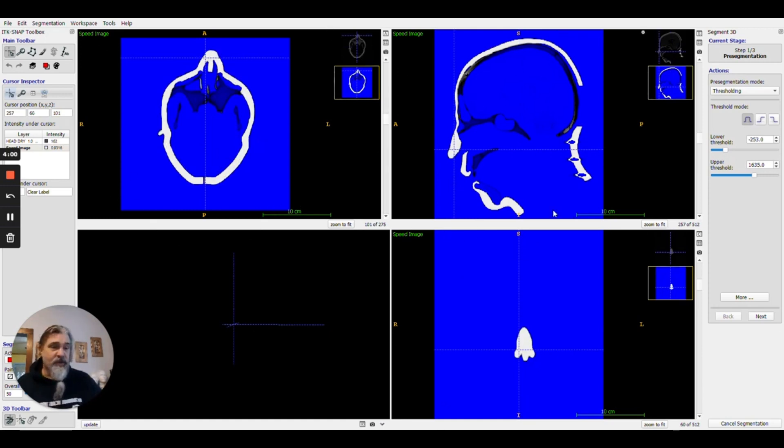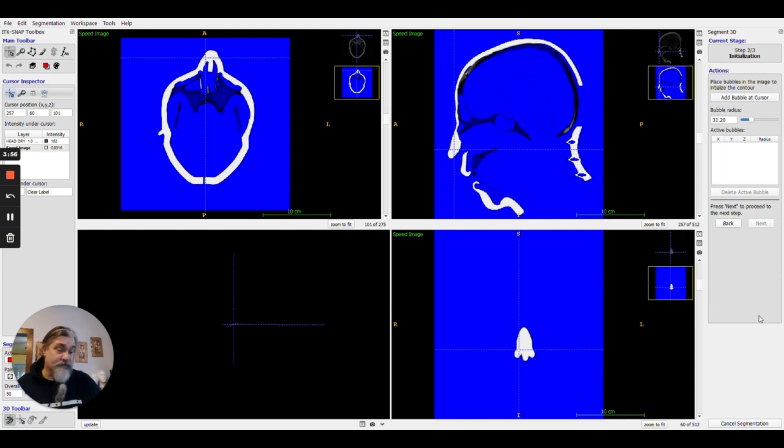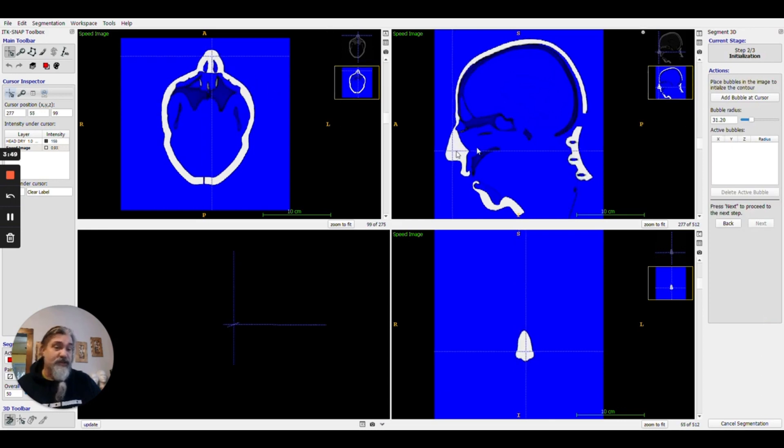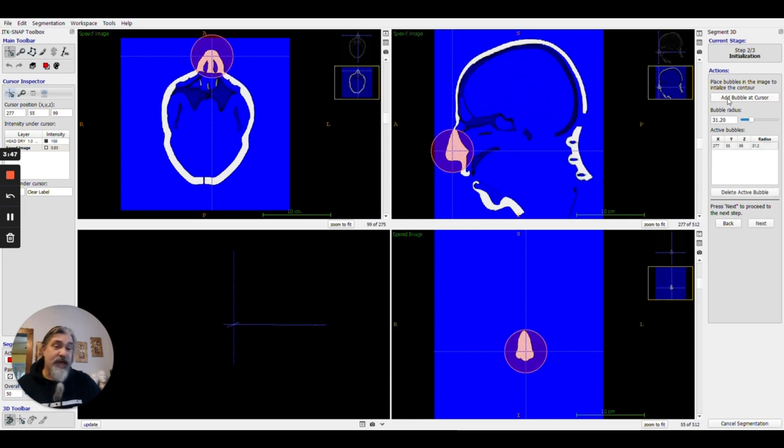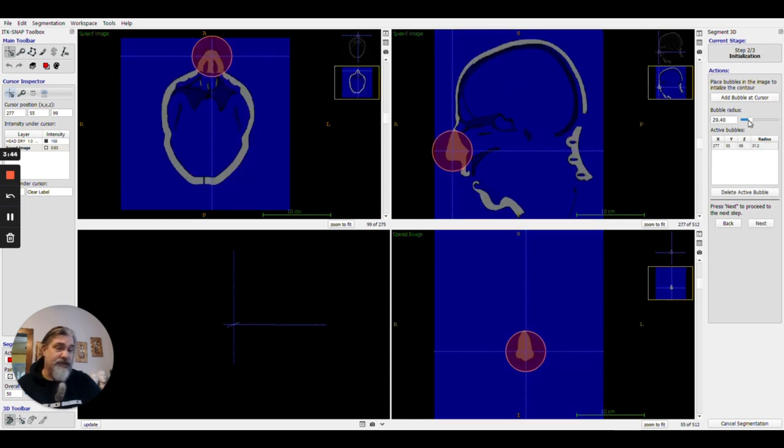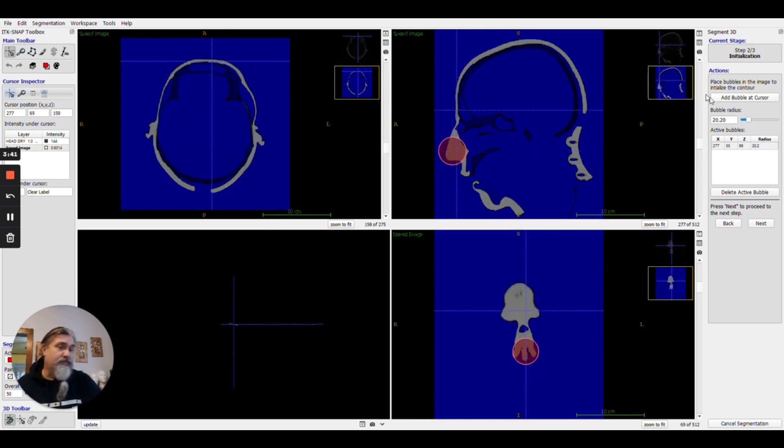Once I've done that I'm going to push the next button and I can then go ahead, and in any of the windows where I've got the cursor selected and active, I can push the add bubble at cursor tool. I can adjust the size of it. Typically I'll leave the bubbles oversized.